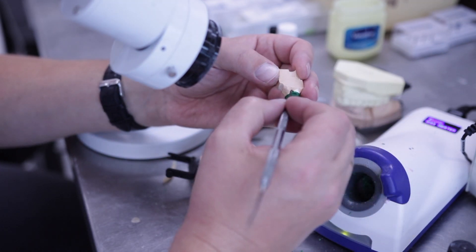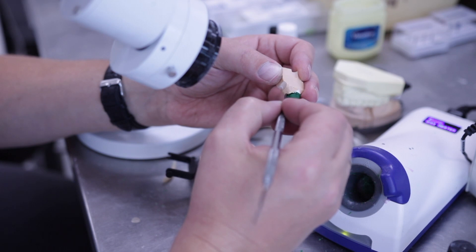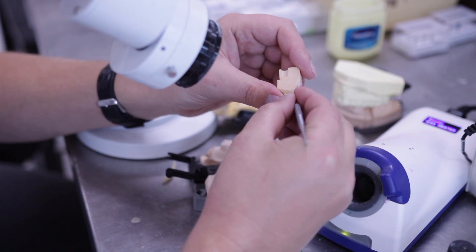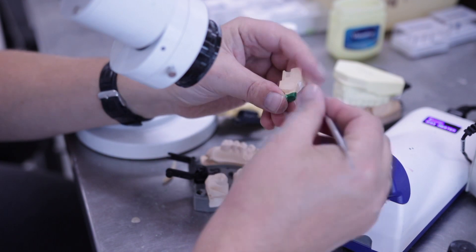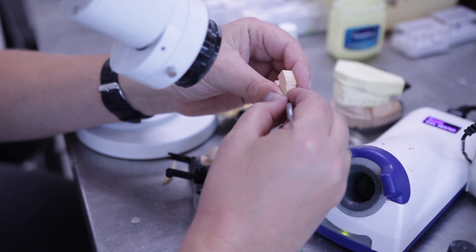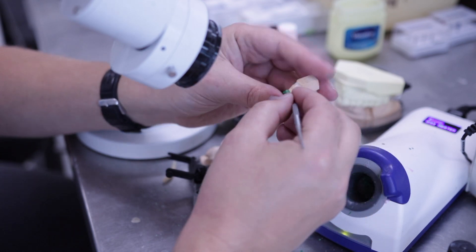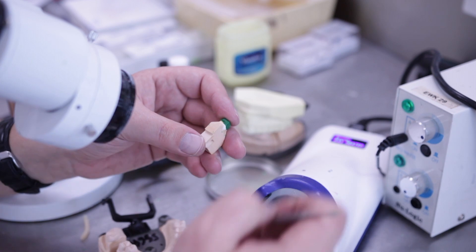The collar should be between 1 to 1.5 millimetres, depending on the gingival level of the preparation. The angle of the collar should reflect the profile of the lingual or palatial aspect of the tooth. Visualise the prominence of the finished restoration when you construct your collar.